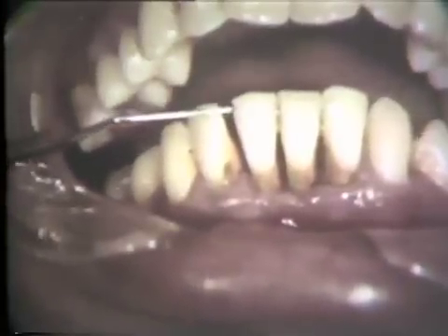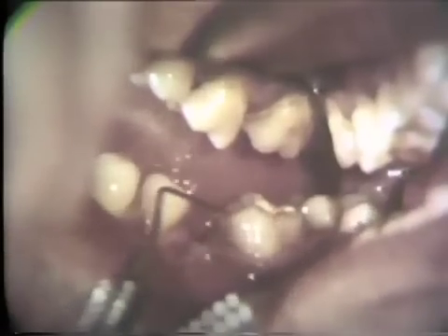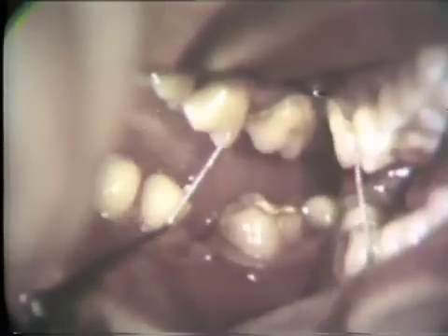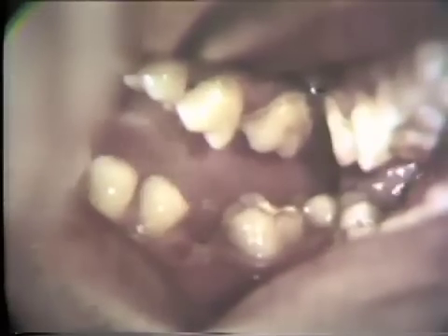The dentition is examined for open contacts. If there is a wide open contact, the approximate distance between the adjacent teeth is measured. If a tooth has been lost, the empty space is measured to indicate any drifting or tipping of the teeth adjacent to the space. Elongation or extrusion of teeth relative to the plane of occlusion is also measured. The measurements of open contacts are transferred to the chart indicated by parallel vertical lines, and the width of edentulous spaces for missing molars and the amount of extrusion of maxillary first molars are recorded.